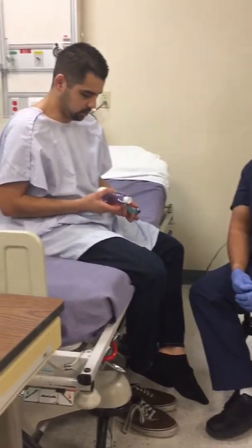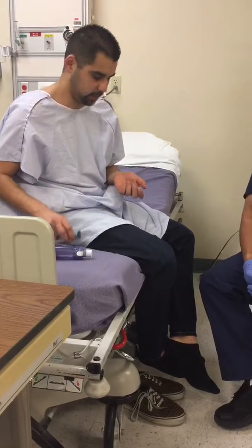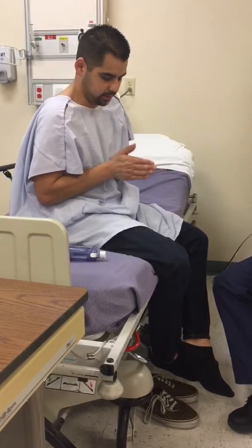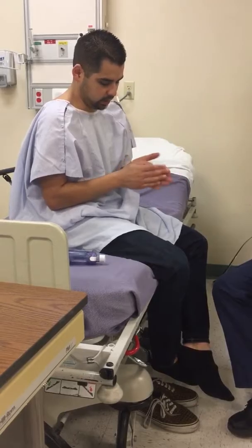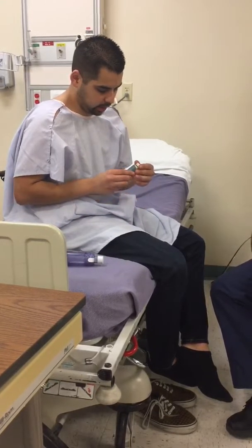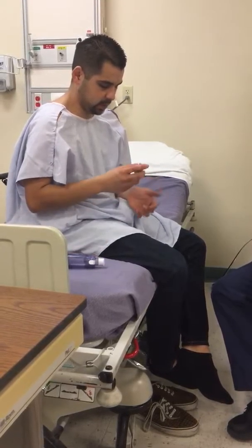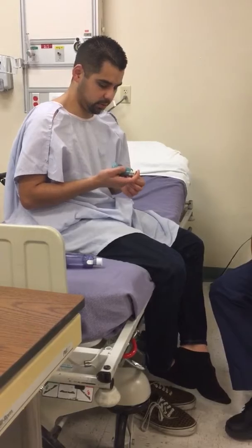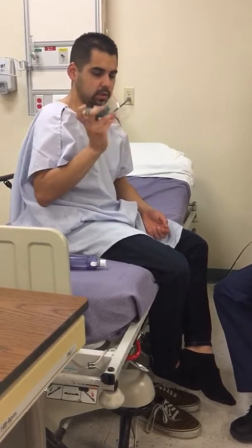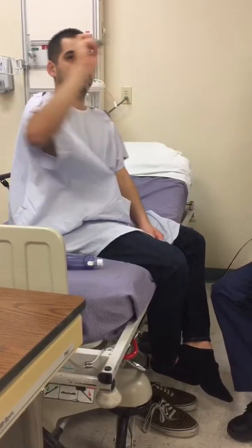Okay. So this is brand new. If this was brand new, I would get the drug and warm it up. This gets the albuterol ready. And then I would put it back into the inhaler, and then I take off the cap. If it hasn't been used, or if it's brand new, I shake it, just to clear dust. And then check to see if it's ready. Then I spray away from me twice.